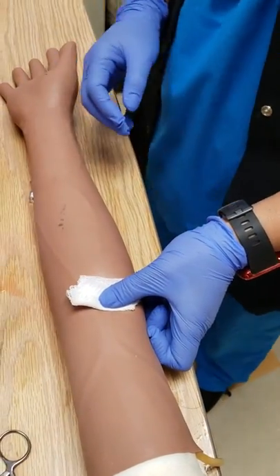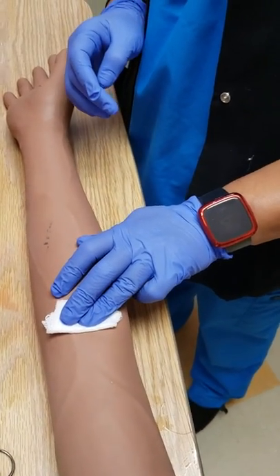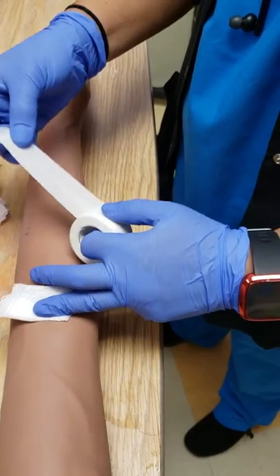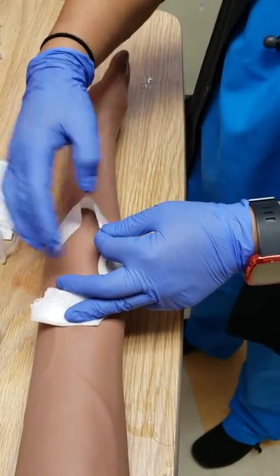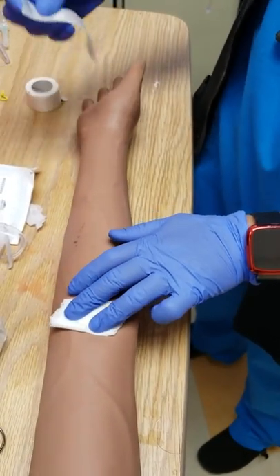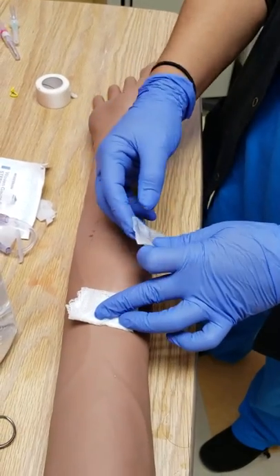I'm going to hold pressure here. Since this patient is on blood thinners I'm going to hold it on there for a little bit. Ideally you should have Coban — that tape they use in the lab when they draw your blood — it sticks to itself. But since we don't have that, we're just going to hold pressure on there for a little bit.